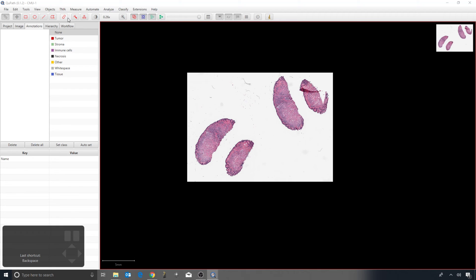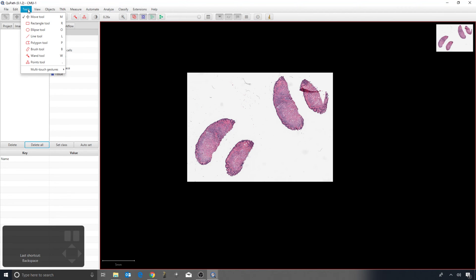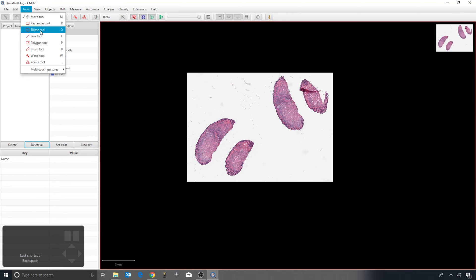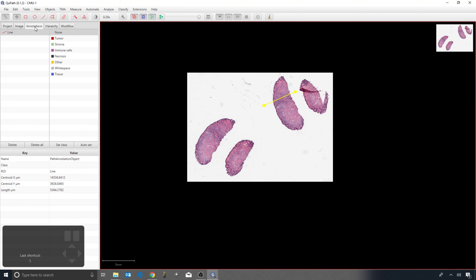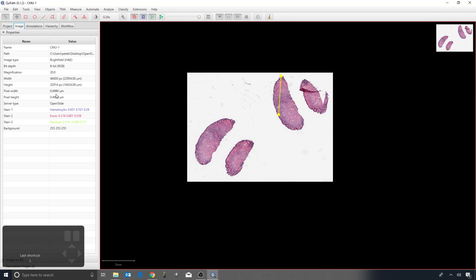These tools are also replicated in the Tools menu, which shows the shortcut keys. In practice, I would press R for rectangle, O for ellipse, L for line, P for polygon, B for brush, and so on — these shortcuts are well worth memorizing if you're annotating a lot in QuPath. For the line tool (L), drawing a line gives measurements; with the annotations tab active I can see the line length in microns at the bottom, based on the pixel width and height in microns stored in the image tab.